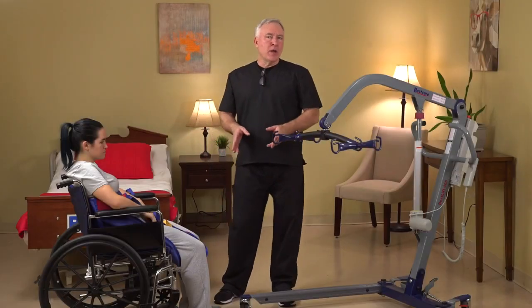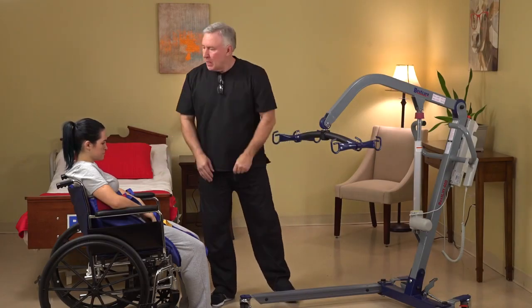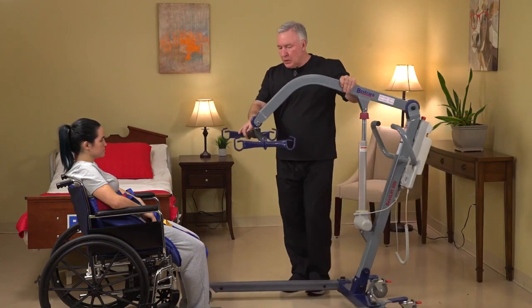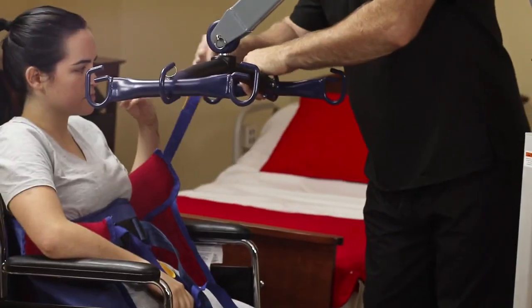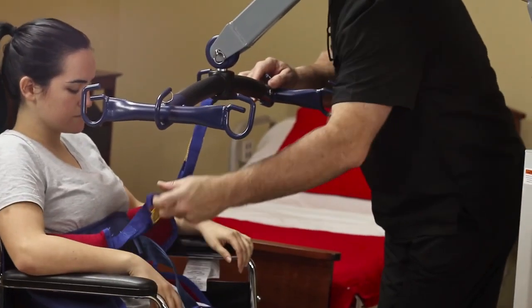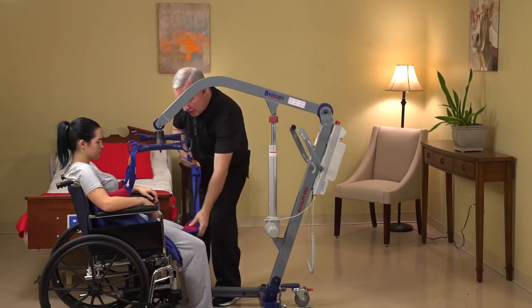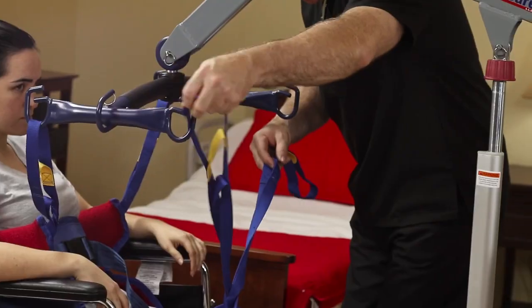Now let's show you how to transfer the patient from this wheelchair to the bed with our Sani sling. Our Sani sling is in position on the patient in the wheelchair. We're going to approach the patient with the lift, open up the base, connect our shoulder connecting loops to the first hooks, and our leg loops to the hooks closest to the lift.